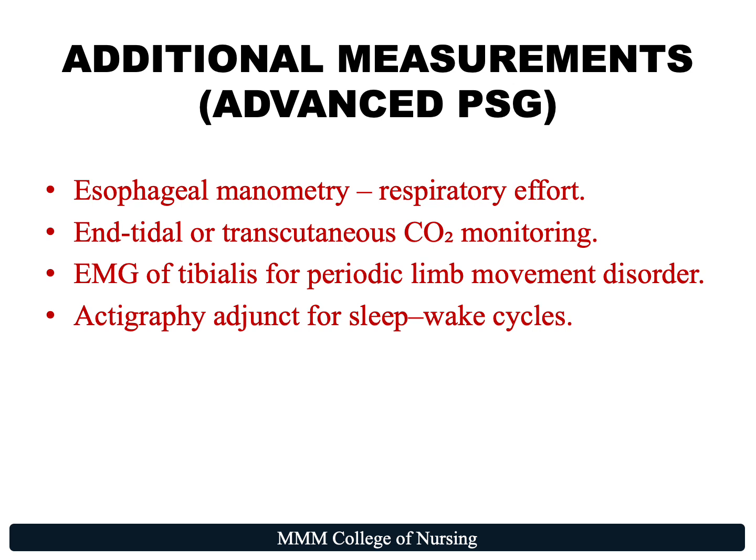End-tidal carbon dioxide monitoring in polysomnography non-invasively measures exhaled carbon dioxide to assess ventilation, especially for sleep disordered breathing like sleep apnea, detecting hypoventilation and airway obstruction by showing carbon dioxide buildup or poor gas exchange, providing continuous data often through nasal prongs to complement the standard polysomnography. This helps in diagnosing pediatric hypoventilation and correlates well with apnea hypopnea index AHI, offering insights into disease severity, post-apnea recovery, and overall ventilation status.